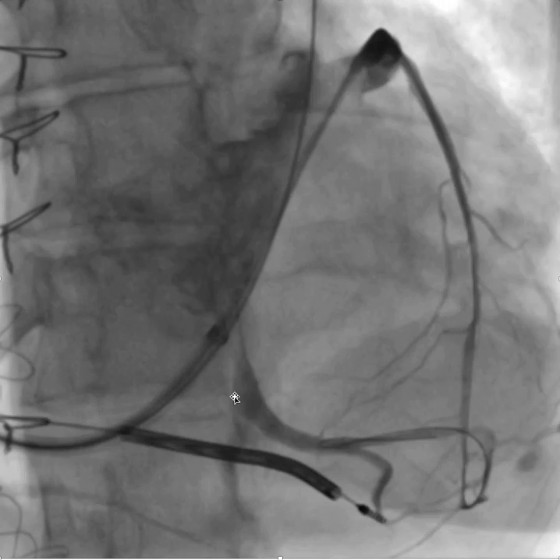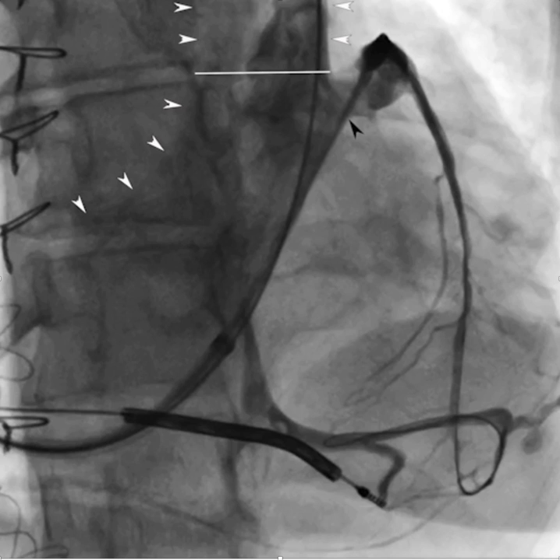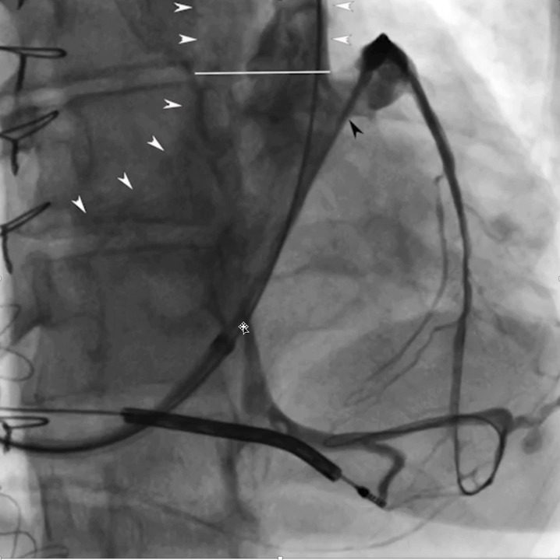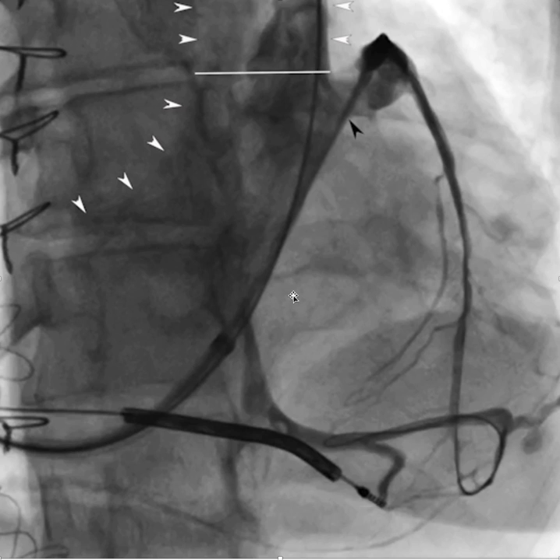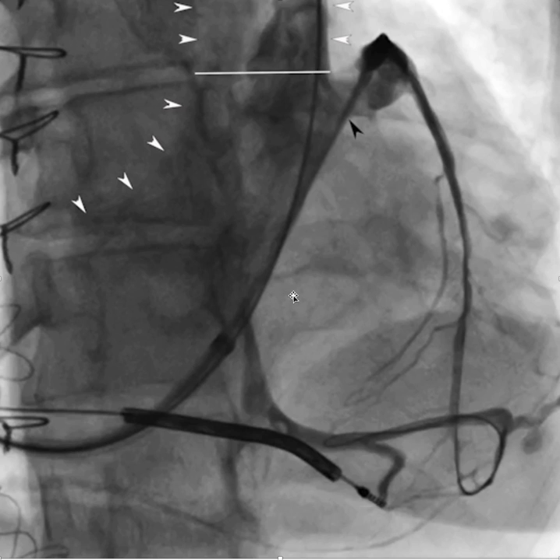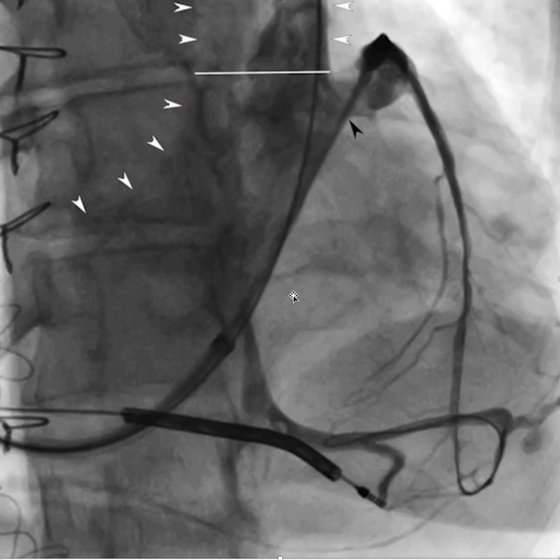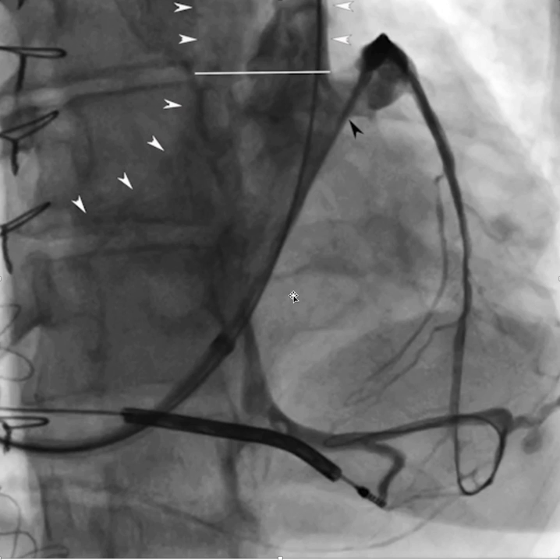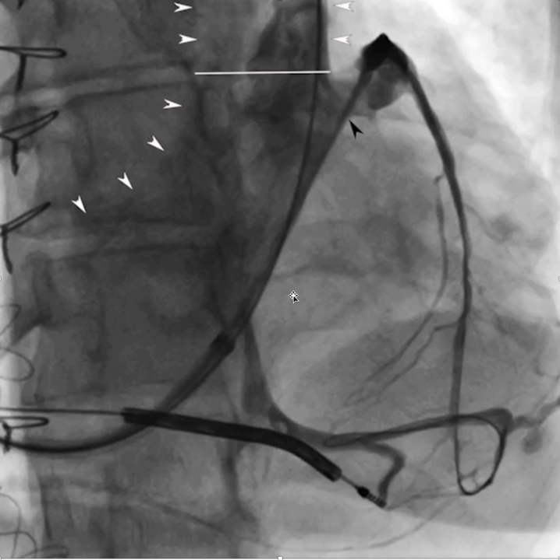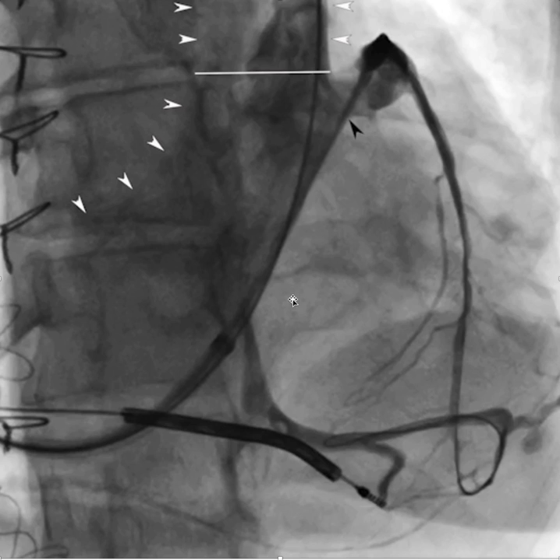This is an example of LV lead implantation in a patient with a persistent left SVC. It's always best to approach those patients from the right side, even if you have to give up your pocket on the left side, because the anatomy is much more suitable for implanting from the right side.